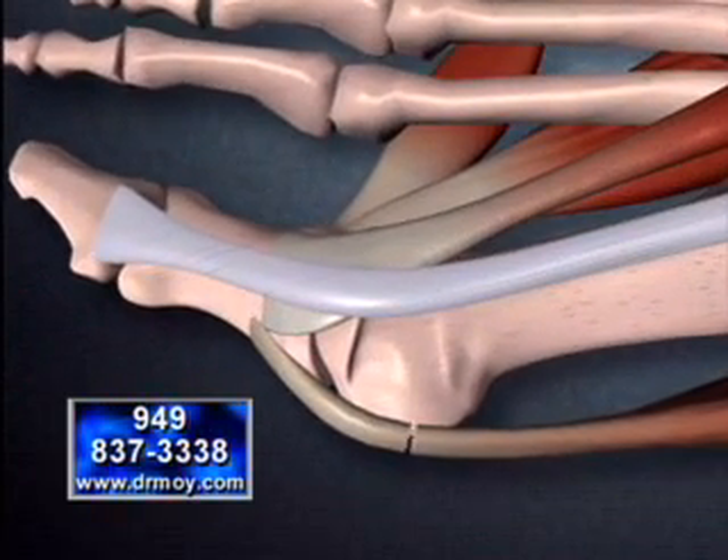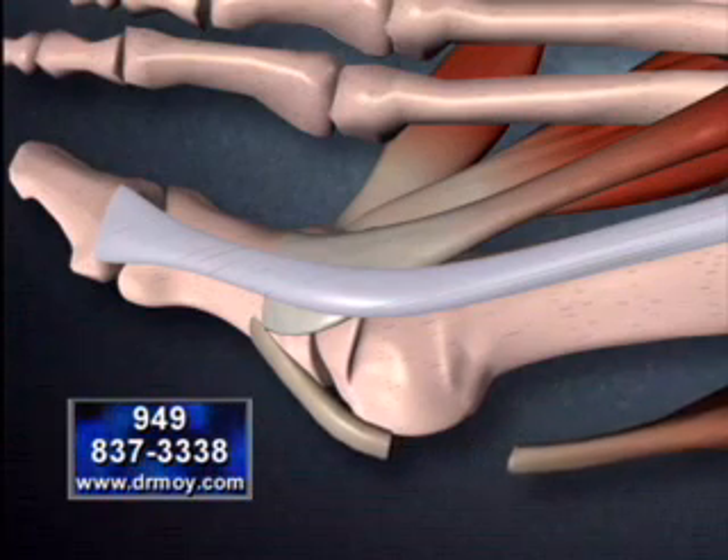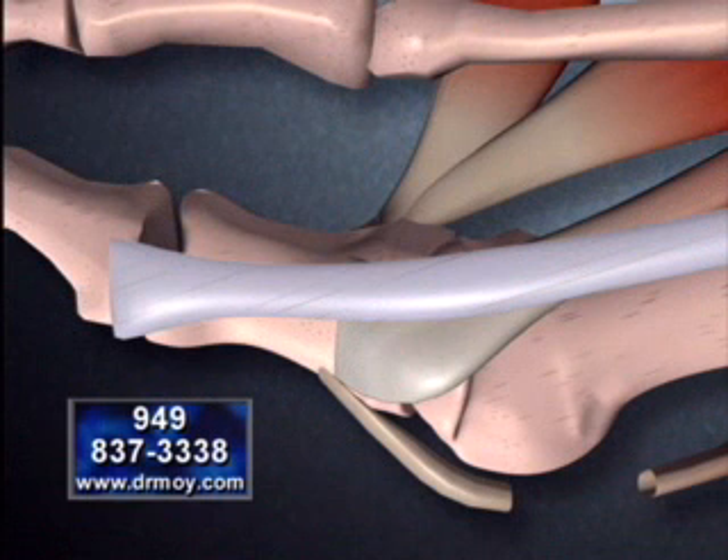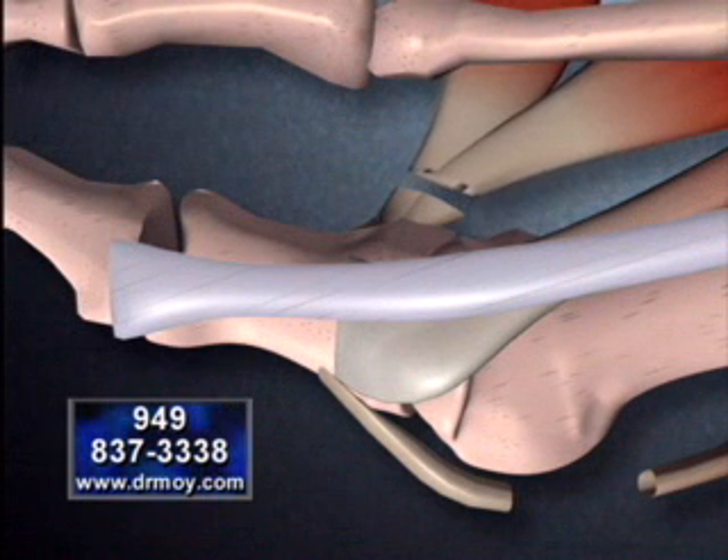we see how cutting the tendon allows for exposure to the abnormal bone growth. The tendons on the opposite side of the joint are also released to eventually allow the great toe to achieve normal alignment.